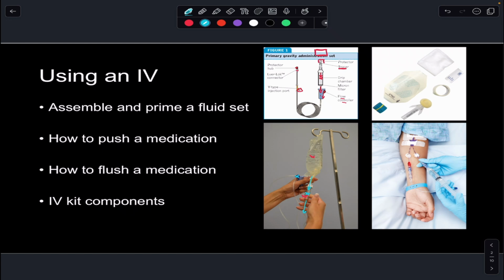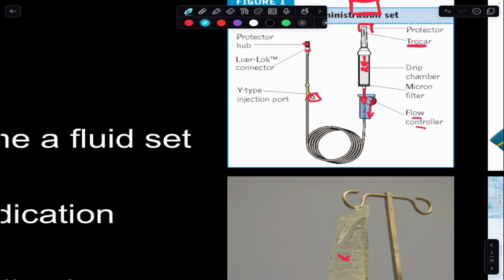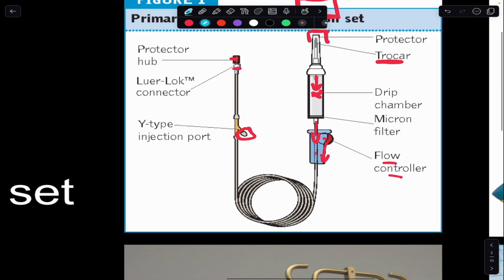Then say you're ready to push a medication, so you're in the OR and maybe you're inducing the patient, and your attending says, hey, would you push propofol or would you push lidocaine? What you'd do is you would take your syringe and you would find this injection port. So this is going to be near the patient's hand. You would attach your syringe to the injection port and push the medication through.